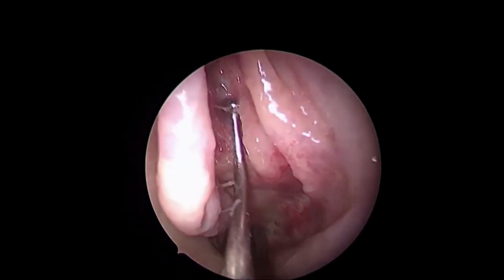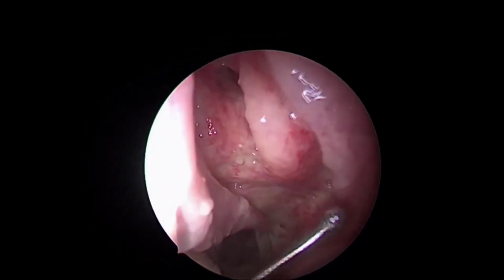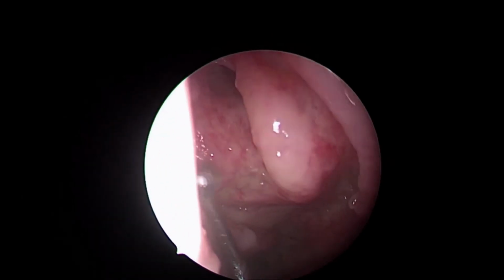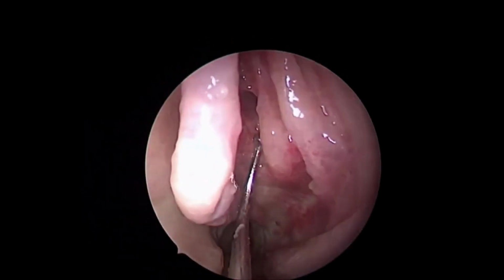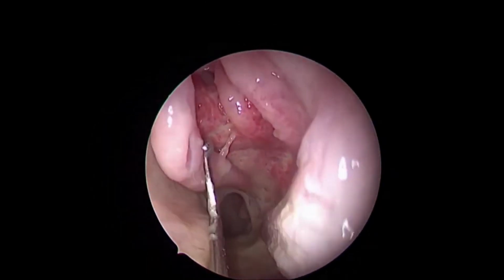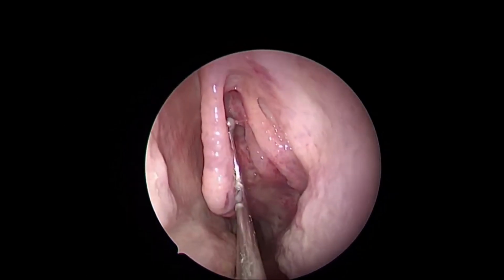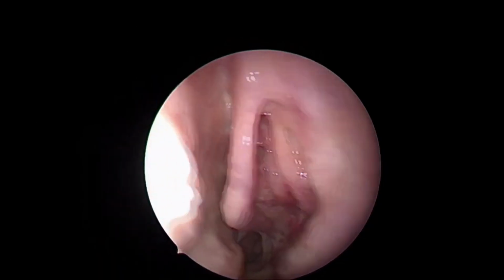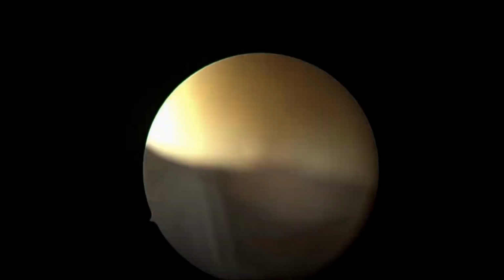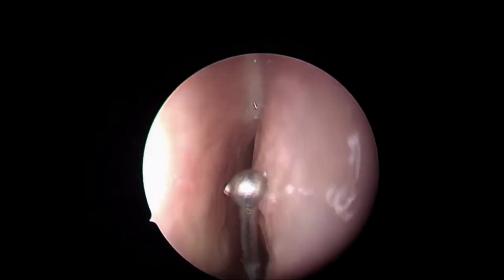The reason is, all the cells which open anterior to the turbinate drain anterior to it. Like all sinuses, maxillary, the frontal through the frontal outflow tract here, and the anterior ethmoids, all staying anterior to the ground lamella, they drain anterior to it. And all cells like posterior ethmoidal and sphenoid, which are behind the ground lamella, they drain behind it through the sphenoethmoidal recess. So this is important anatomically as well as functionally, as we deal with a surgery known as functional endoscopic sinus surgery. So we have to all the time respect anything which has a bearing on the function of the nose overall.